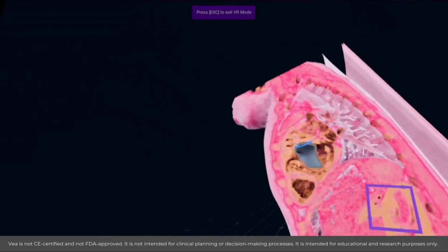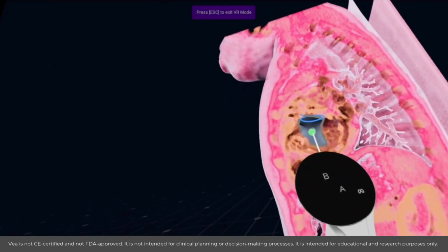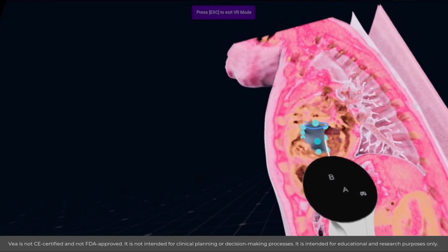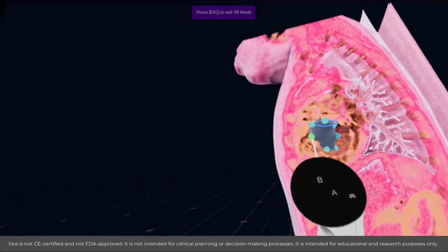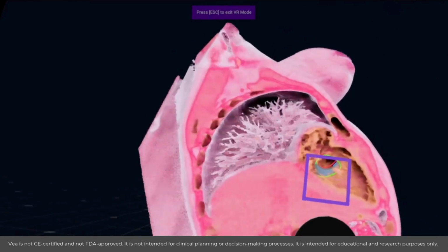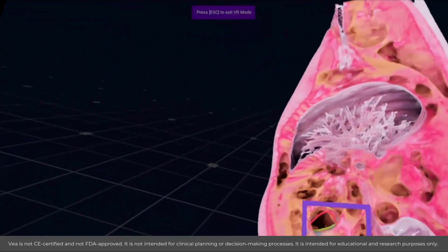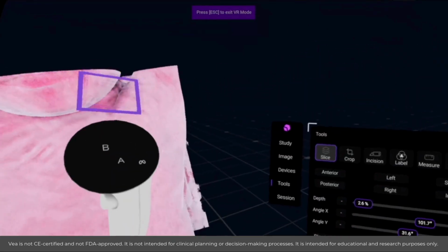So to prevent subaortic stenosis, we need to contour the patch a bit more liberally, and we are doing this by expanding the patch. And once expanded, when we review the LVOT from below, you can notice that the LVOT has widened. And even from the aorta, you can see a straight path to the VSD.